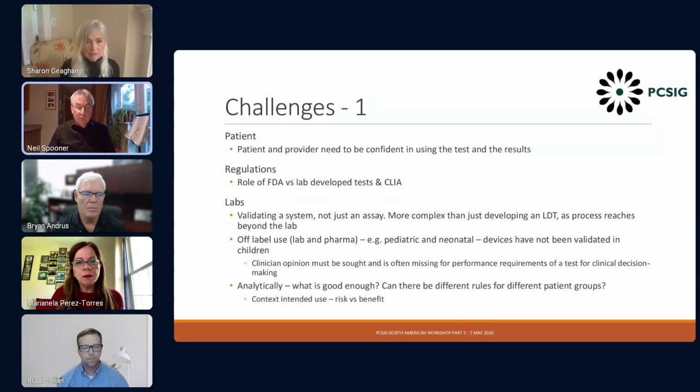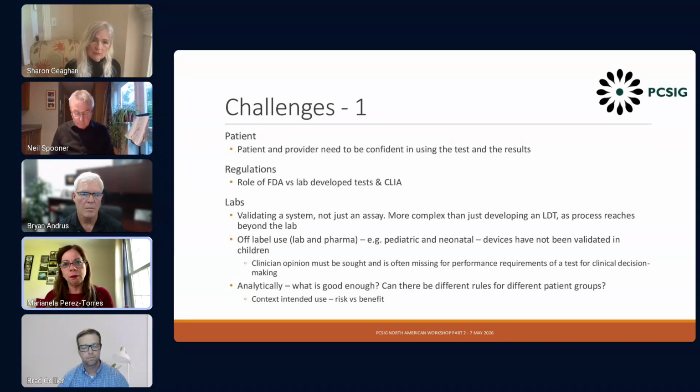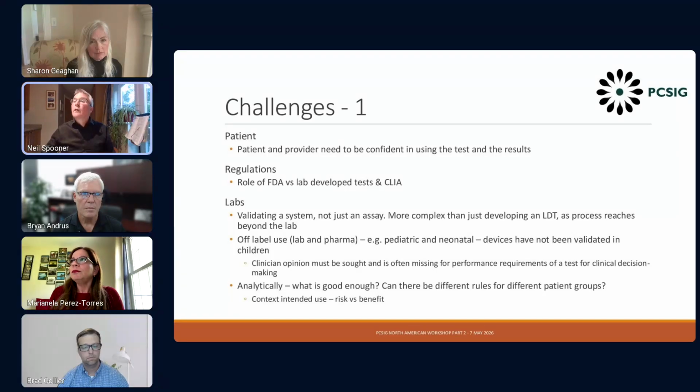I would say, I think it was Bryan who mentioned before, not all devices are created equal. So making a standardized collection device procedure might not be the type of standardization you're looking for, but rather the characteristics of the instructions that you're looking for, the simplicity part, the mechanisms that manufacturers will put in place to ensure that anybody that receives and decides to use these devices can do it successfully. Yeah. Yes, agreed. Okay.